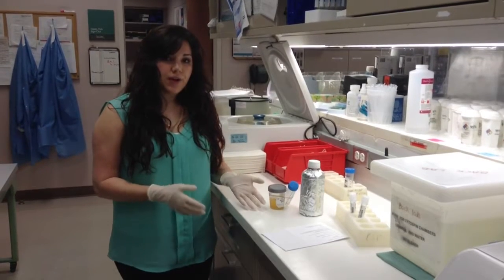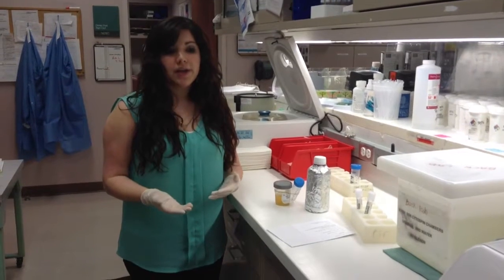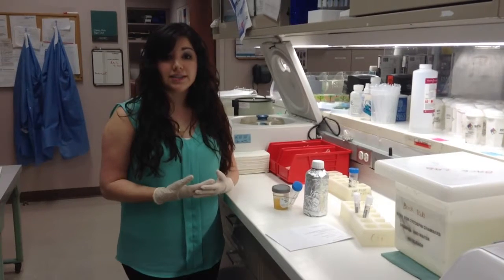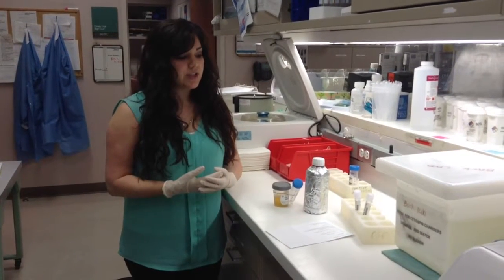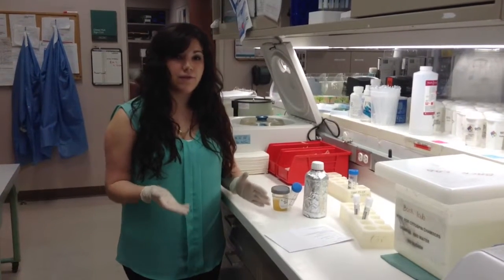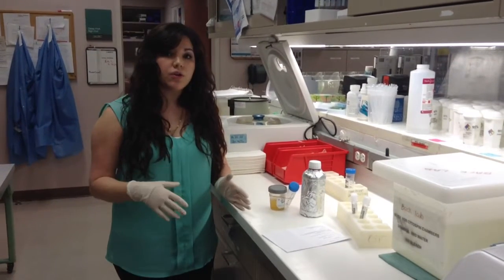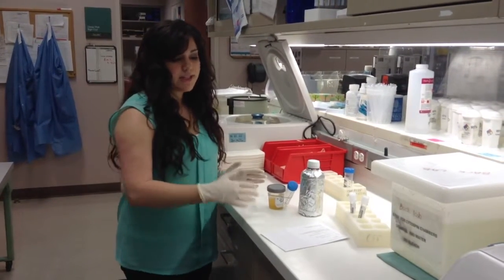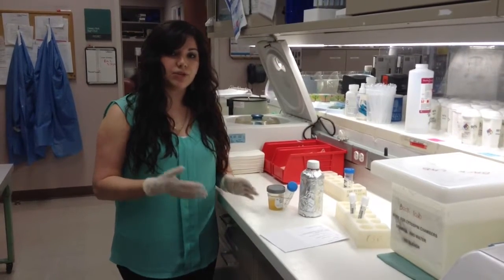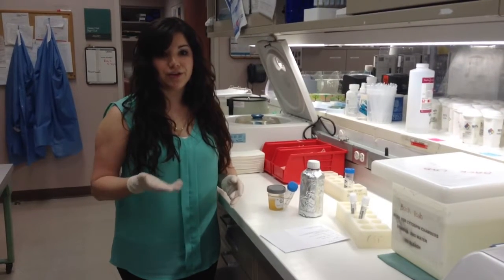Additionally, I would like to just recommend you have the freedom to do whatever you feel most comfortable with, but keep in mind that CSF cases are very difficult to recollect should there be an error, and so I would recommend actually just reprocessing a finalized CSF for the first couple of times. Then you can move on to live cases with the student. I would also continue to recommend processing side by side so that you can watch how they perform every task and make sure that they're doing it properly in a safe and good manner, good practice.